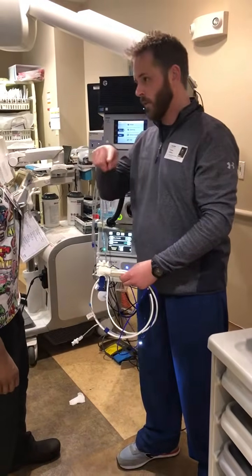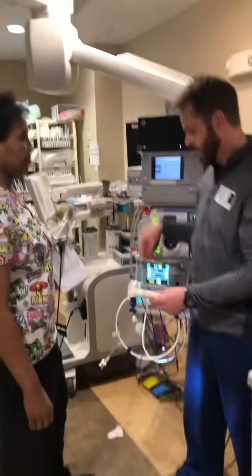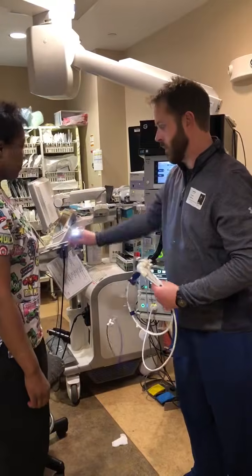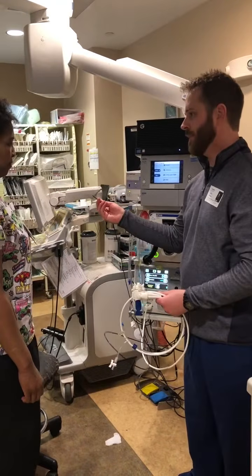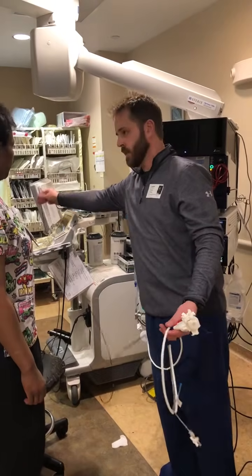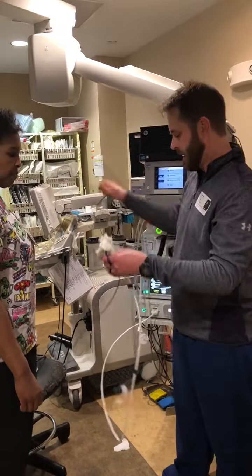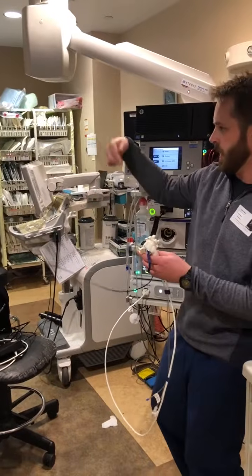And you have a wire right now that's coming out of your ERCP scope that you're managing over here, your long wire. You're just going to backload that long wire over spy. You can always cut the light source off if you don't want to be blinded during that process. So just make sure this is nice and straight. You're going to start backloading that, and what's going to happen is Rastogi or Ollier, so if you hold this, so you're over here and you're dealing with that wire.